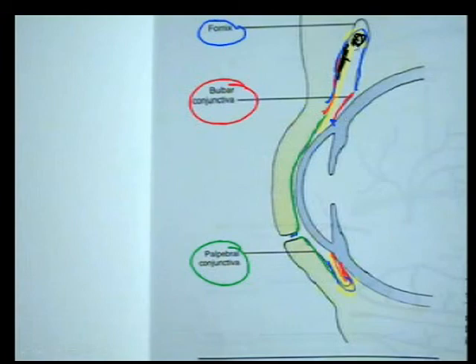The beauty of this is that no contact lens can go any further than the fornix or conjunctival sac. You know, some patients are very concerned that that contact lens, if it gets loose in there, is going to go right back probably to the brain. Not the case. Can't go any further than either the upper conjunctival sac or the lower conjunctival sac.